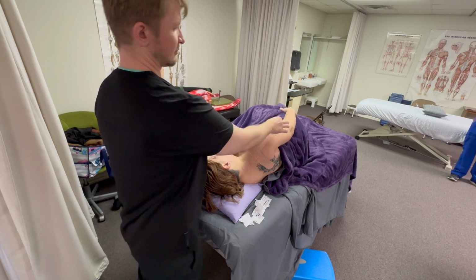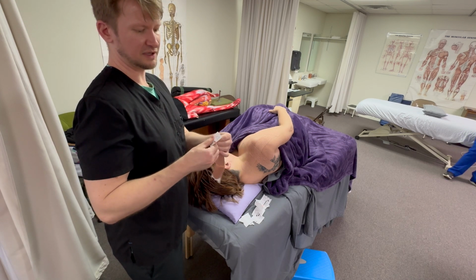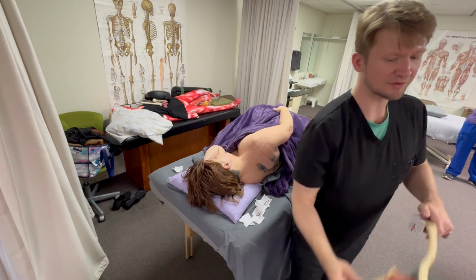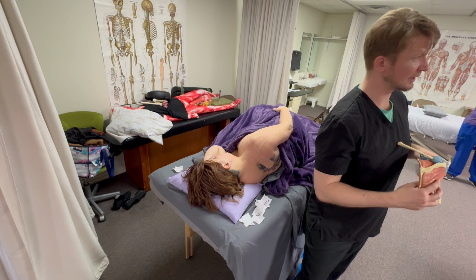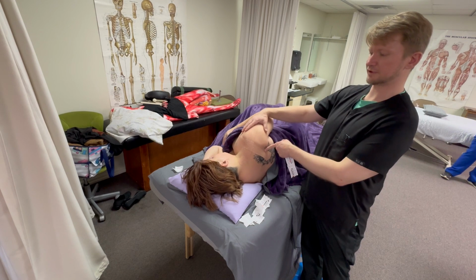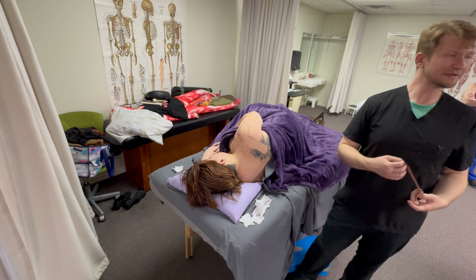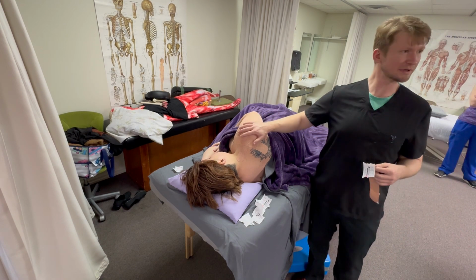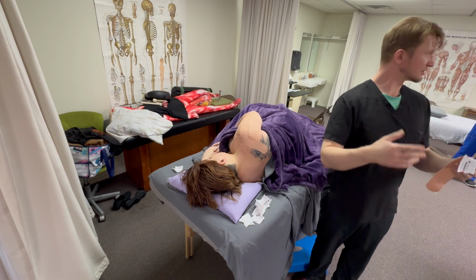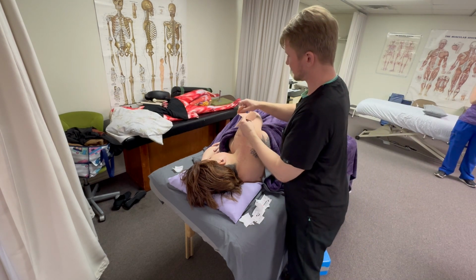From right here back. And this one's not going to be long enough for me to go all the way back, so I'm going to think more infraspinatus. I'm going to think about that muscle. Now she just gets to roll forward for me, lengthen the tissue. That's the only part where this can get messy, is when you're having to tape, especially around a ball and socket joint like this. You have to move the person a lot to make sure whatever you're taping is long. So it just takes a little extra time.